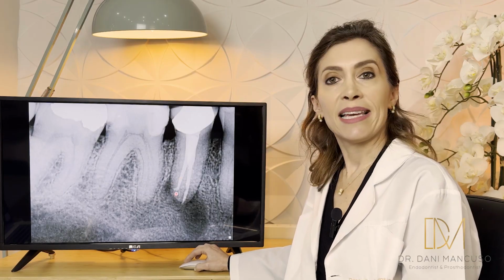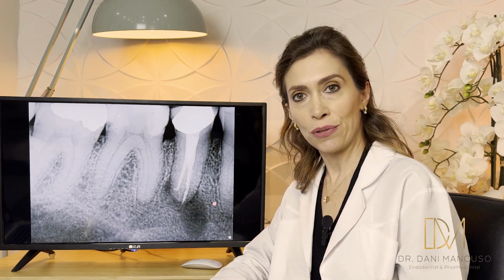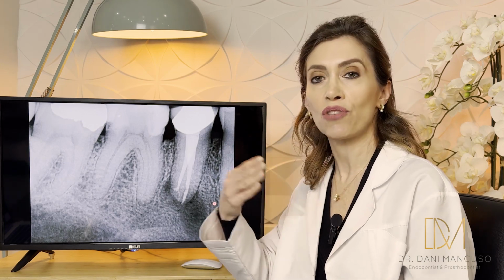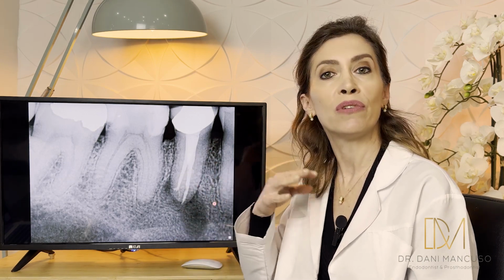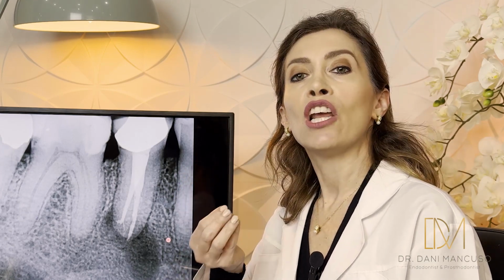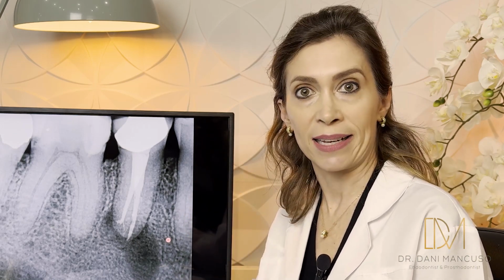What you can see is that every time you are disinfecting a tooth, you need to disinfect both canals. You can't just retreat one. You need to retreat both of them. It's important for you to enlarge a little bit in this area to visualize the second canal.